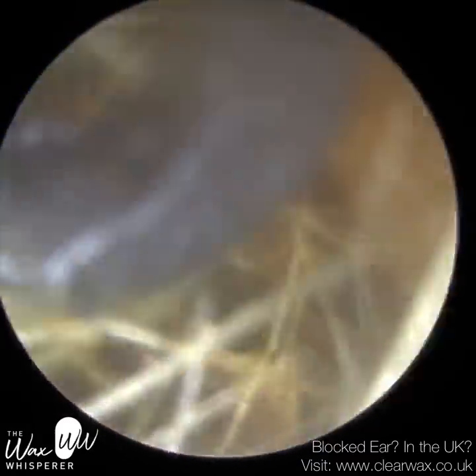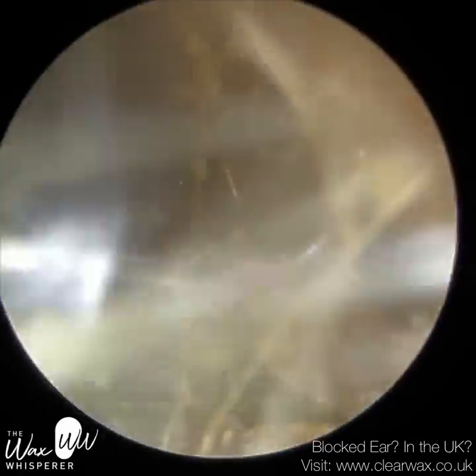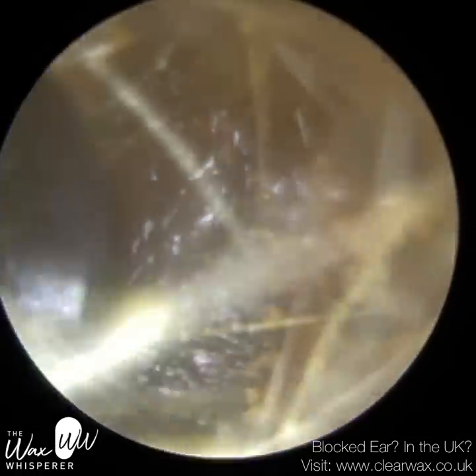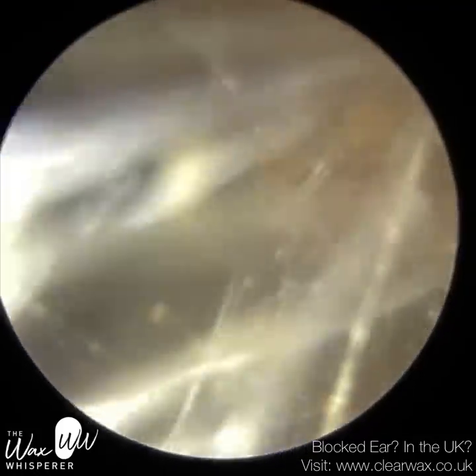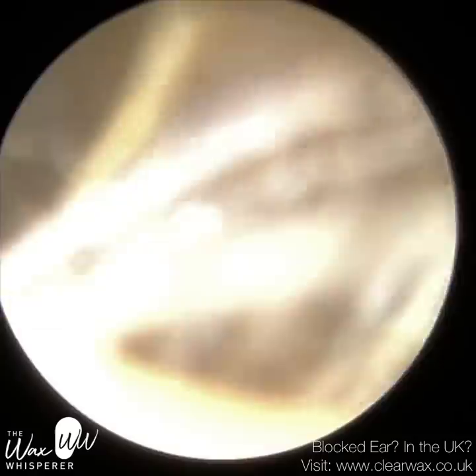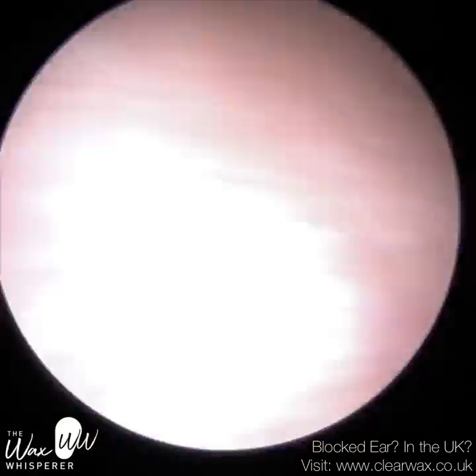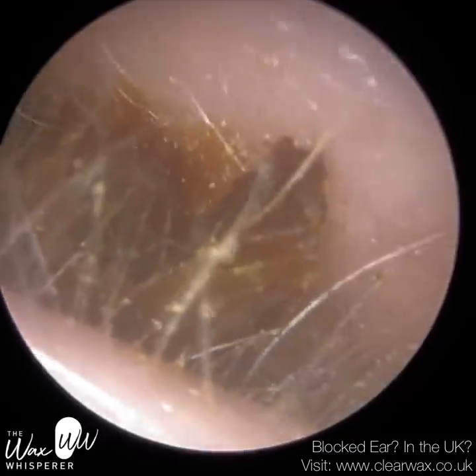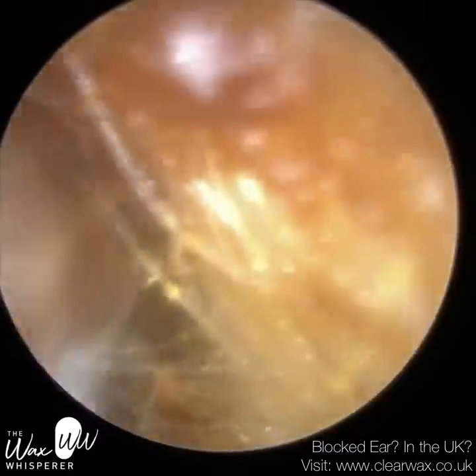I'm going to use a Jobson horn — I felt a lot of resistance initially with the suction probe. The plug of wax and skin is probably a bit too soft for a hook, as the hook would just dissect through it. Whereas with the Jobson horn you've got a larger surface area, so I'm trying to shovel it out using it like a spade. I got a little bit there, and you can see it separated as I was removing it. I've just gone back in with the suction probe to remove that.